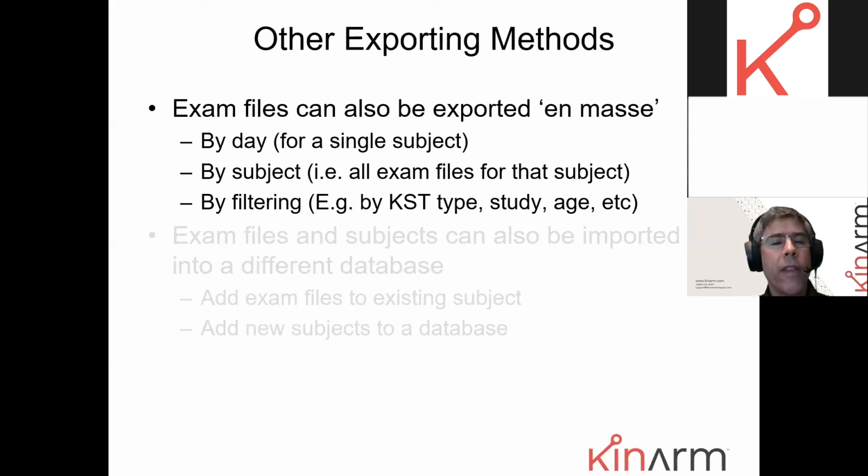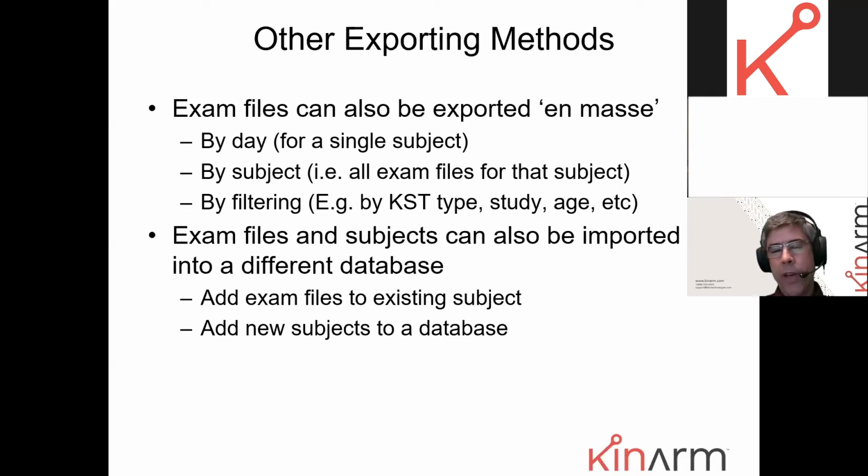There are a number of other exporting methods, and which one you use depends on what you're trying to do. You can export files by day for a single subject, you can export by the whole subject, or you can export by filters. For example, you might be running a particular study, or maybe you're interested in a particular task type. Once you've exported all that data, you can import it into another database, which allows you to manage your data locally, say on your laptop or in your office.